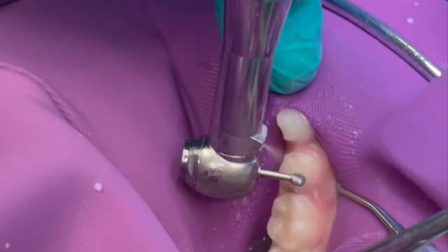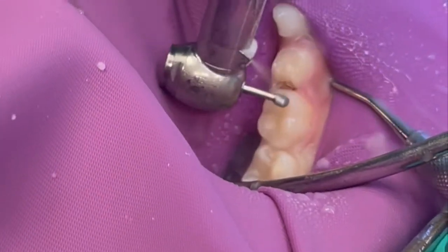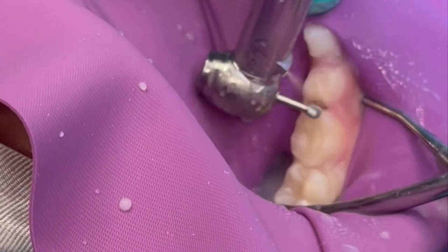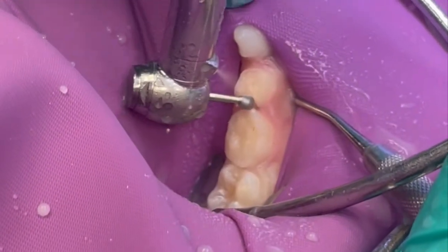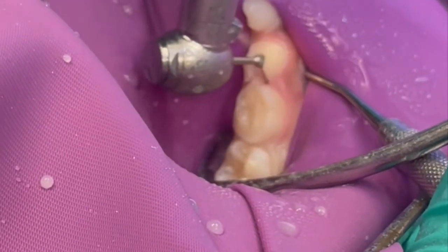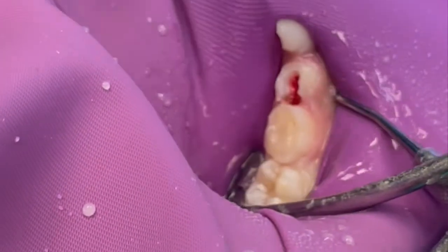Our first step is complete cavity preparation under some type of isolation using a high-speed burr. Excavate all carious tooth structure using that burr. I like to use a round 8 for my occlusal reduction and initial caries removal. In this case, we're doing a pulpotomy on S, an SSC crown on T because it has mesial and distal decay, and a glass ionomer sealant on number 30 using GC Equiaforte. In multi-rooted teeth, you want to access the pulp chamber and remove the coronal pulp tissue to the level of the orifices, and we'll show that a little later in the video.